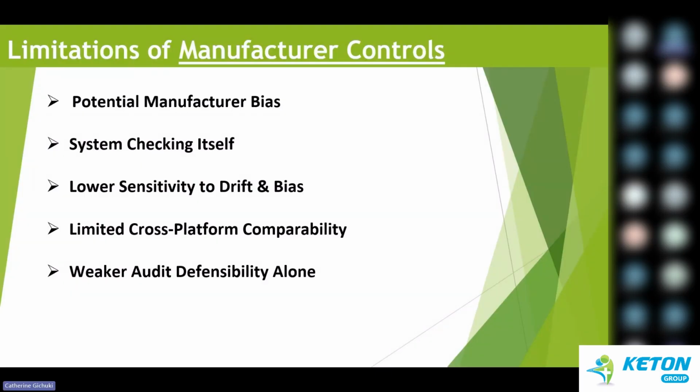Limited cross-platform comparability. They are platform specific, so it is usually very difficult to compare results across different machines and sites. They also have weaker audit defensibility alone. When you are defending yourself with these QCs only, it is a little weak, because reliance on vendor QC only may be questioned during audits and investigations.